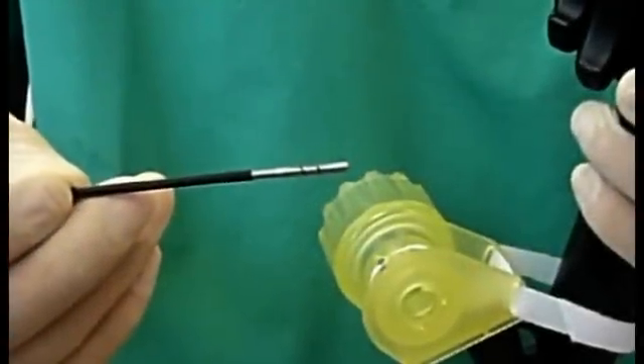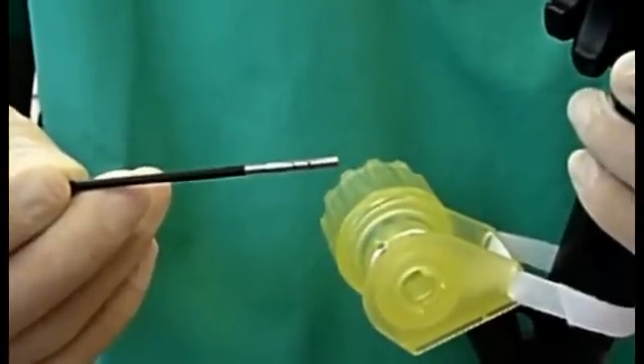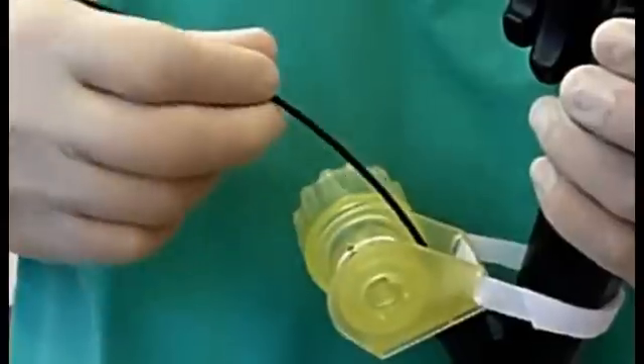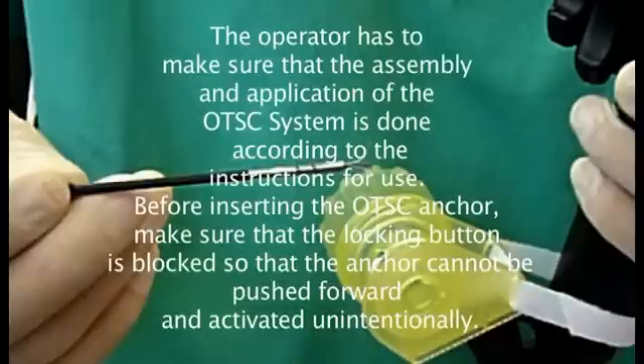After assembling the OTSC system, the OTSC anchor is introduced into the working channel through the rubber valve of the OTSC handwheel attached to the endoscope's handhold. If the OTSC anchor is introduced through the same working channel which contains the thread of the application cap, the minimum diameter of the working channel should be 3.2 mm. The operator has to make sure that the assembly and application of the OTSC system is done according to the instructions for use.